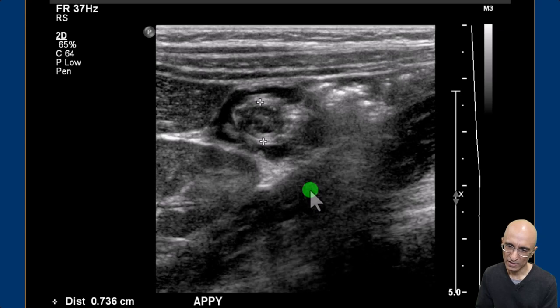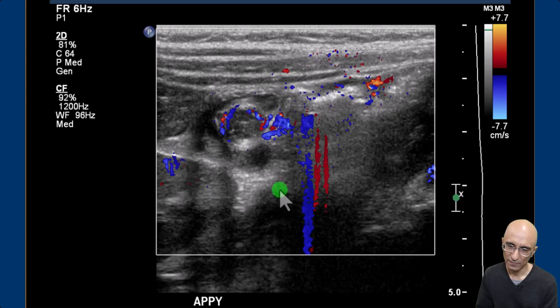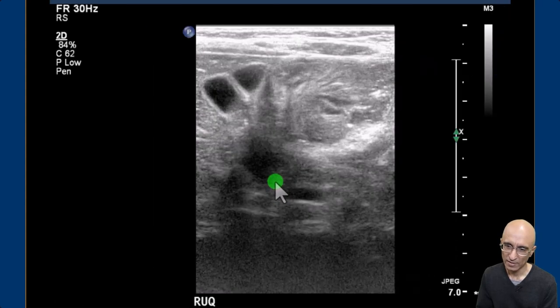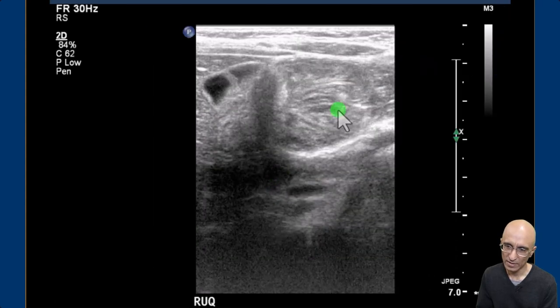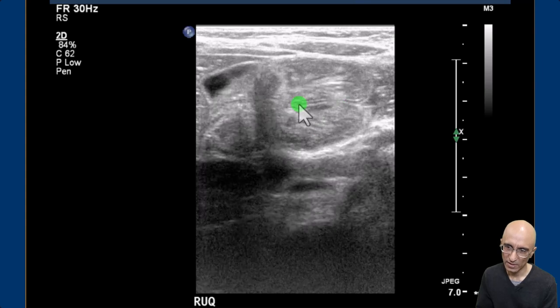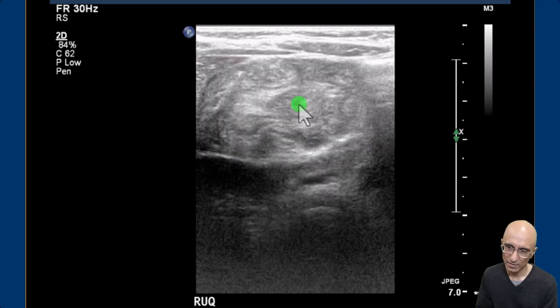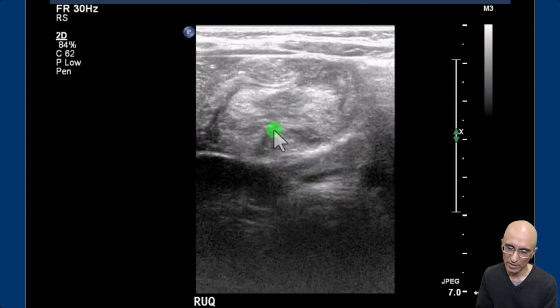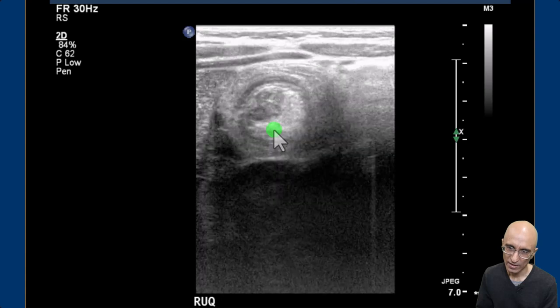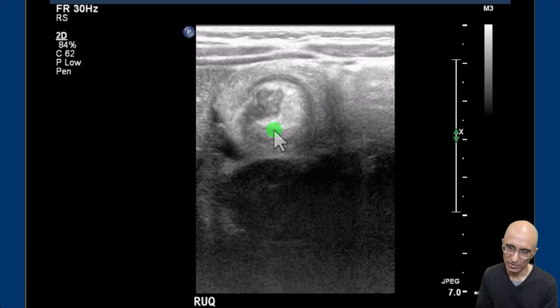The appendix within the intussusception was slightly dilated, probably reactive to the inflammatory changes, with mild hyperemia. On the cine images, as I scroll, you can see this is the region of the terminal ileum which is telescoping into the colon. You can clearly identify this as I scroll through, giving the targetoid or donut appearance.